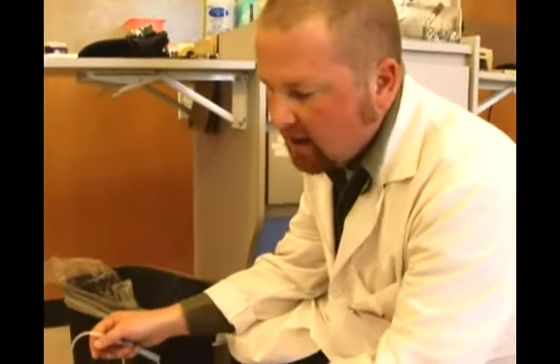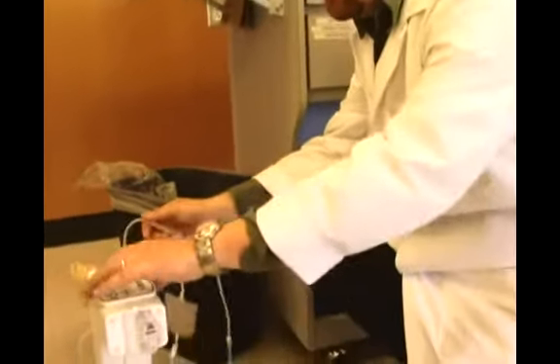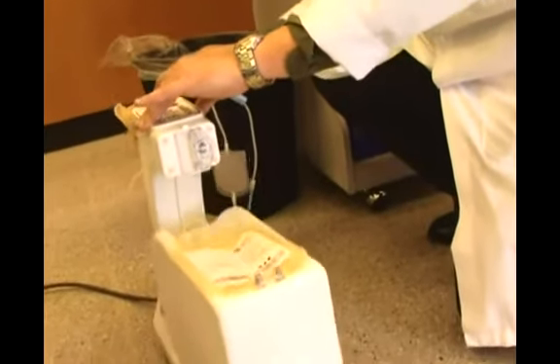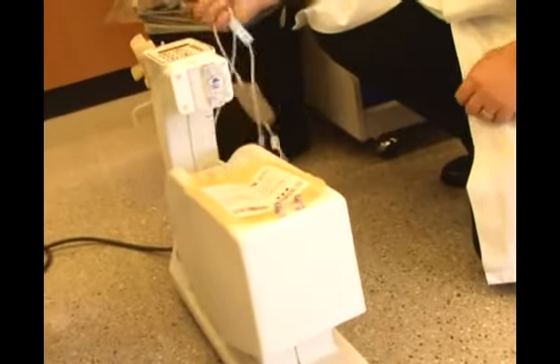So when it's done and it hits 565 grams, it's going to ring and clamp, so then we know when the donor's finished.